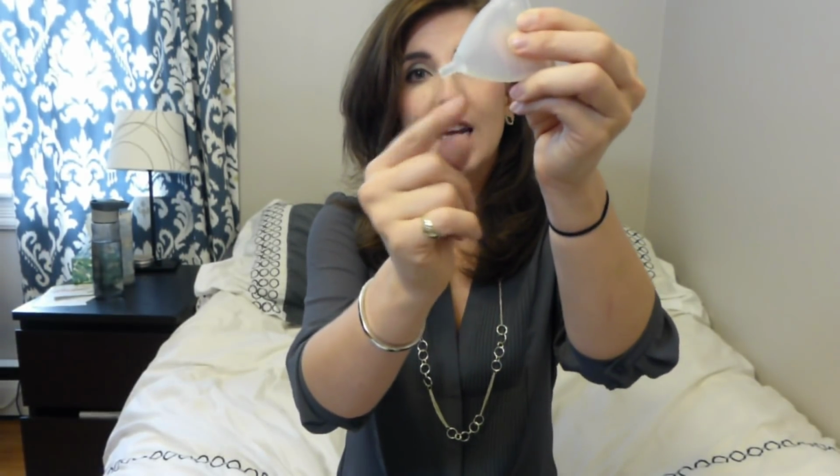The best part about the Diva Cup is it really doesn't need to be changed that often, usually about 2 to 3 times a day. And when you're changing it, you mainly are grabbing this little tail part, pulling it out, dumping it into the toilet, and then rinsing it in a sink. You can also use the Diva Wash, which is the product that they sell. It's specifically designed to work with the Diva Cup. It doesn't have any harsh chemicals or artificial dyes, fragrances, and bad things like that, but I have found that pretty much any all-natural face wash works just fine as well.